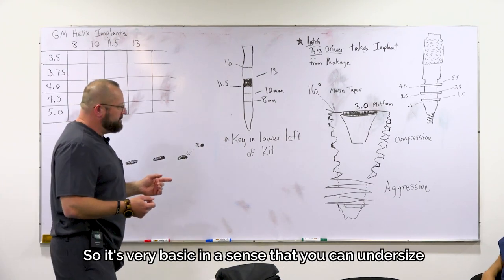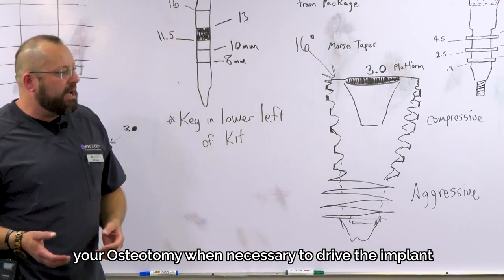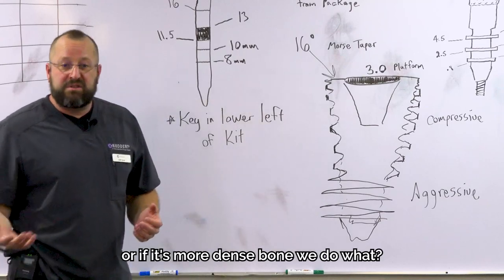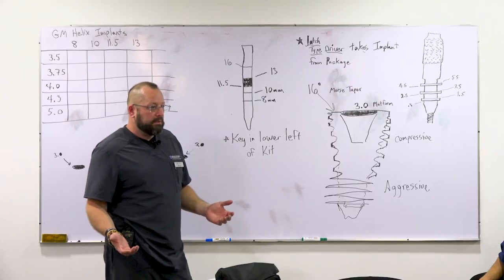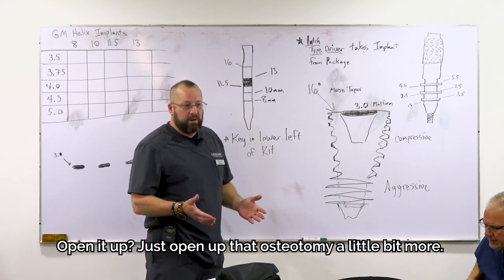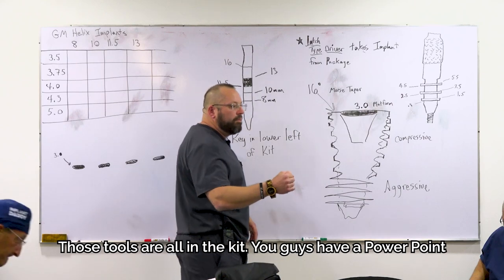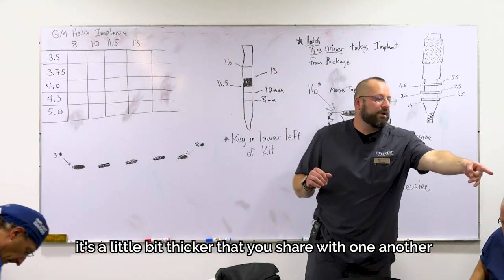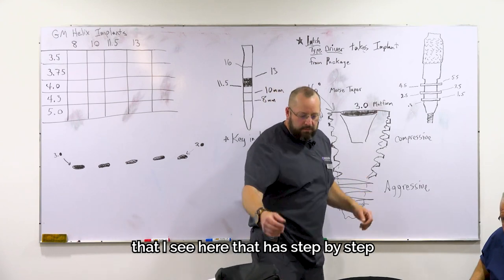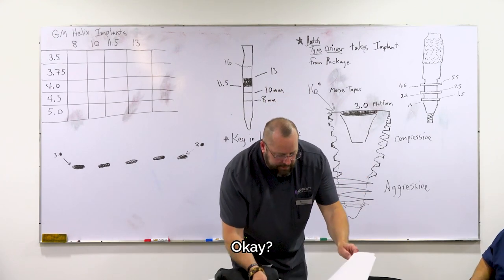So it's very basic in the sense that you can undersize your osteotomy when necessary to drive the implant for primary stability. Or if it's more dense bone, we do what? Open it up. Just open up that osteotomy a little bit more. Those tools are all in the kit. You guys have a PowerPoint, it's a little bit thicker, that you share with one another that I see here that has step by step what each of those tools does inside the kit, okay?